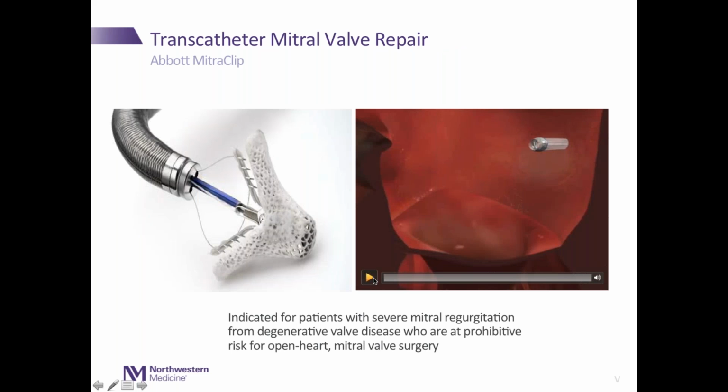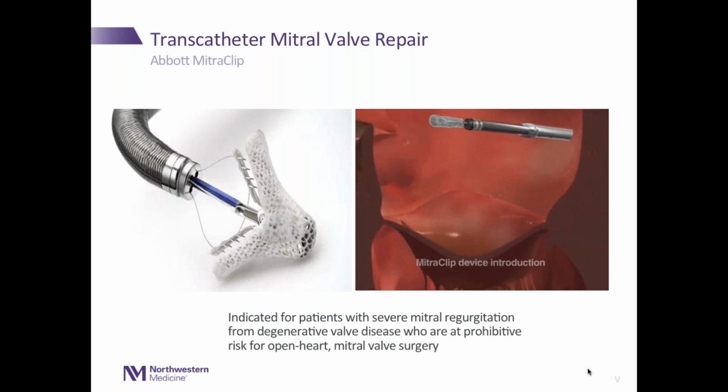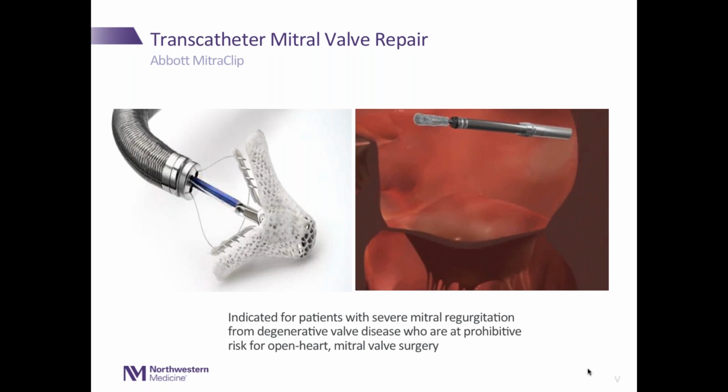Now, there are a group of patients who will not tolerate open mitral valve surgery. So here comes a great application for transcatheter procedure. This is a device called the Abbott MitraClip.